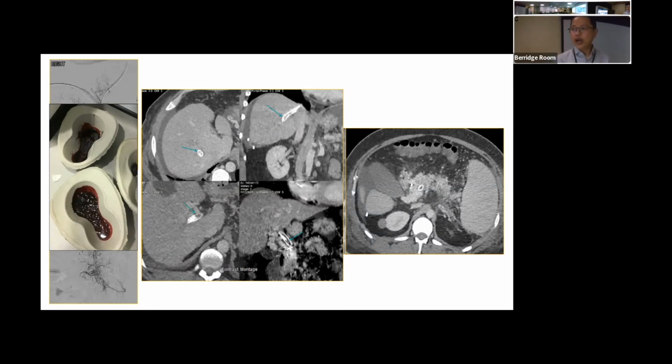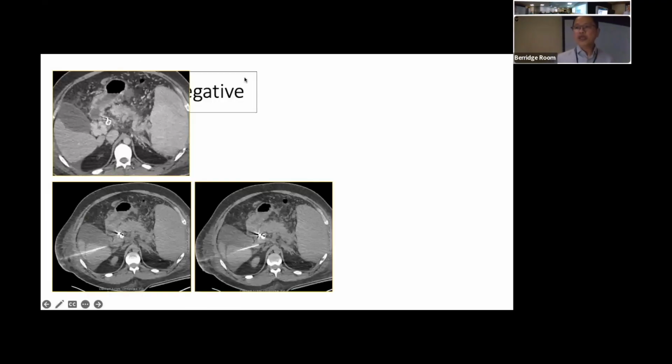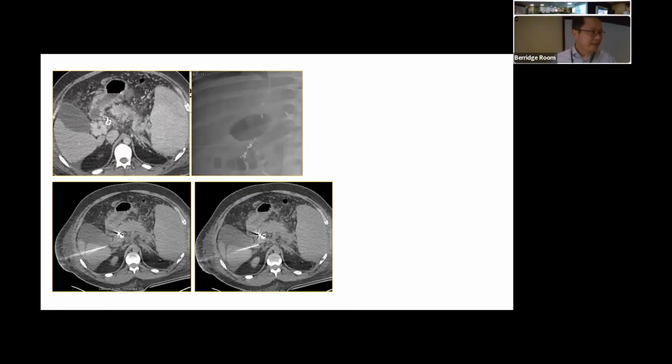So we were asked whether we could embolize that varix percutaneously. So the patient came to a CT scan. This is the varix here adjacent to the gallbladder, and this is the liver. And we did a transhepatic access to that particular varix. And I then moved him from the CT to angiography. It's only a few levels, but anything can move, the needle. So you will see here, he already has the TIPS, and already has the coils from previous embolization. This is the Chiba needle, very thin.